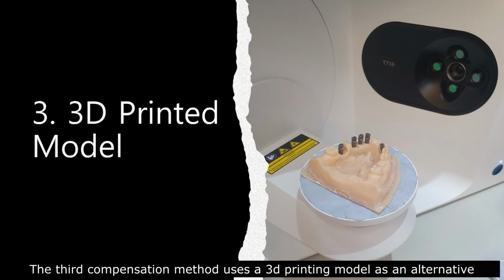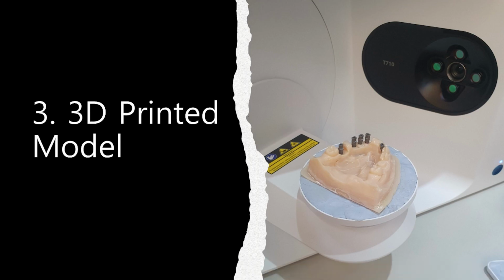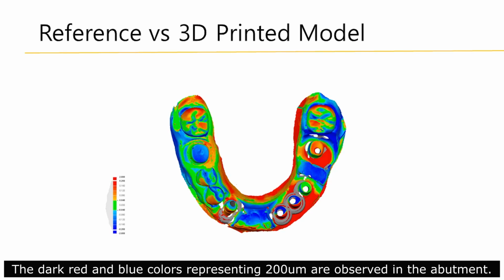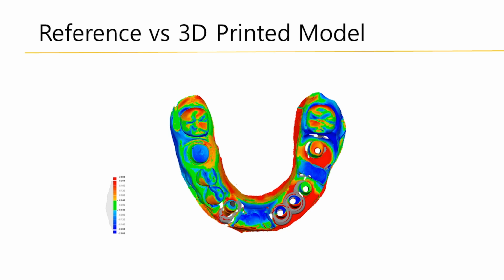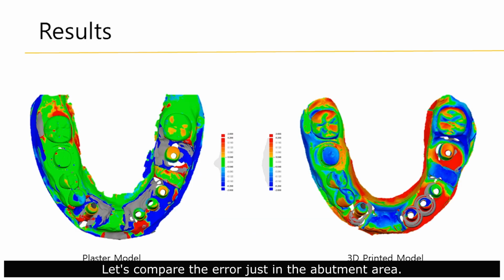The third compensation method uses a 3D printing model as an alternative to the lack of impression obtained by an intraoral scanner. The dark red and blue colors representing over 200 micrometers are observed in the abutment. The error in the model itself is also large, so it is not advisable to use it in a large model like this. Let's compare the error just in the abutment area.